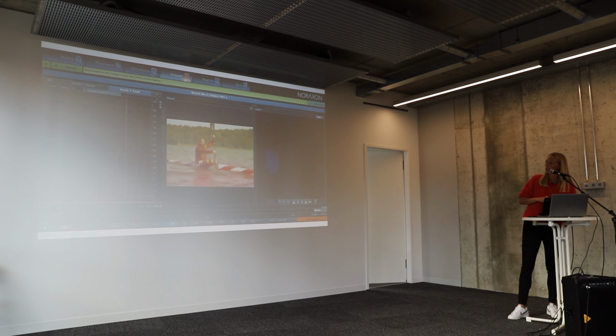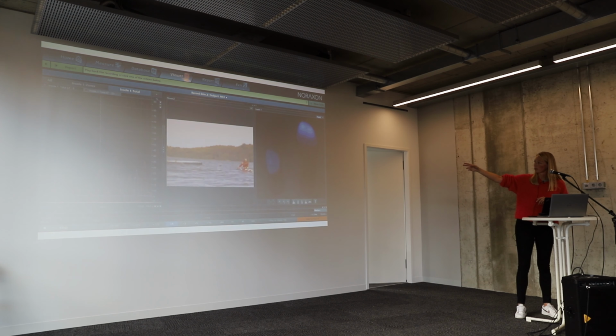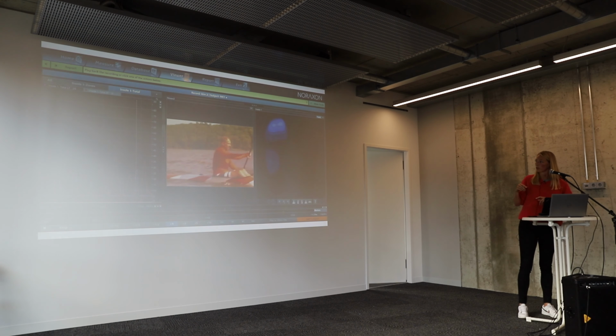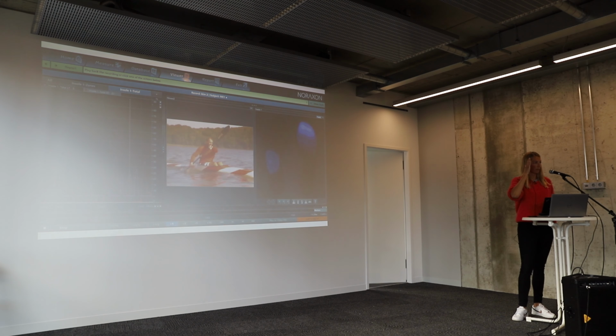Okay, but it's a little bit hard to see here. On the left we have the two insoles, two different colors, purple and red. Then you see him in the middle, of course, and then the pressure from the insoles on the right. So this was a success to me because it shows that I can get data out in a nice way. It's not that obvious up here, but maybe you can see it on the screen, and it's quite precise when the timing is going on, when the peak is, and when he's releasing the force again.